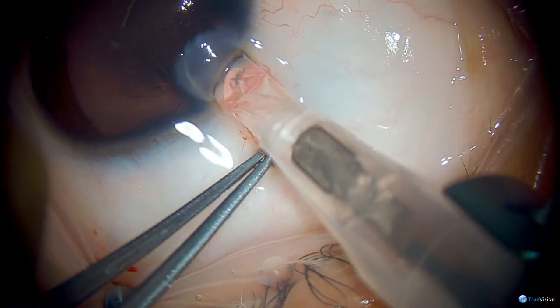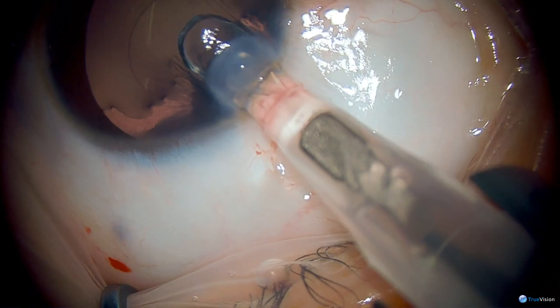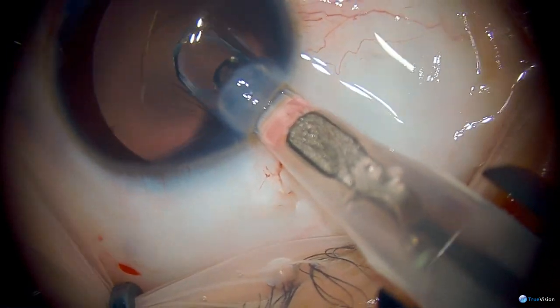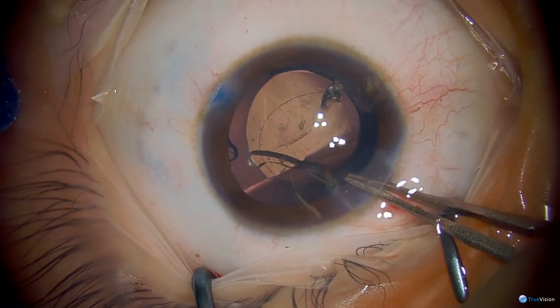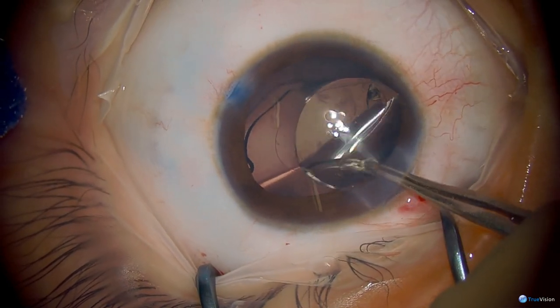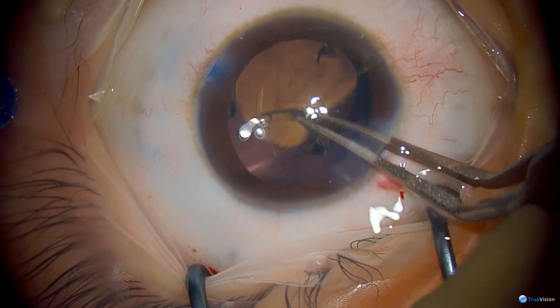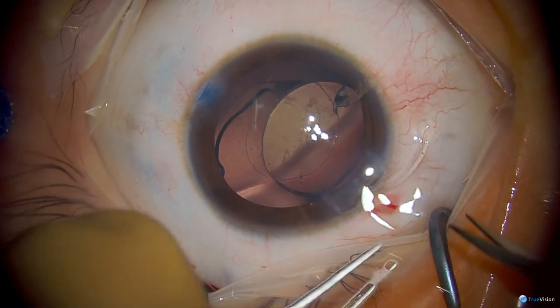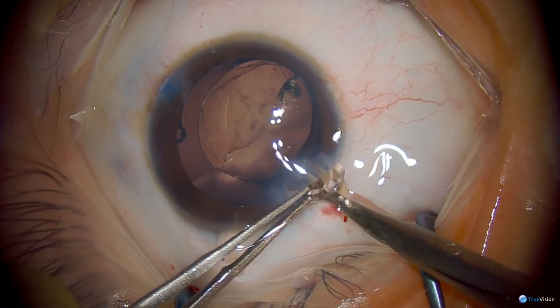During the injection of this one-piece lens, you can see the plunger is out a little bit further, perhaps than normal. And once the lens is in the eye, it's visible that there's a crack in the lens implant off to the right hand side. Now fortunately it's peripheral, but there are some other scratches and cracks extending in towards the middle. And the decision is made in this particular case to explant the IOL and simply replace it.